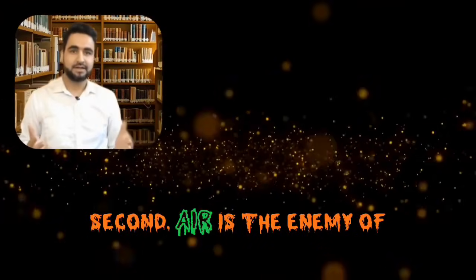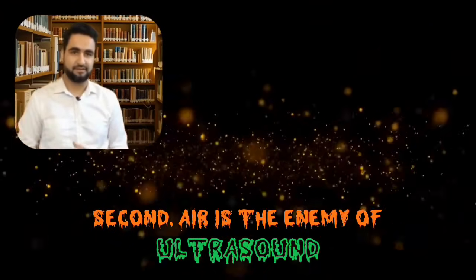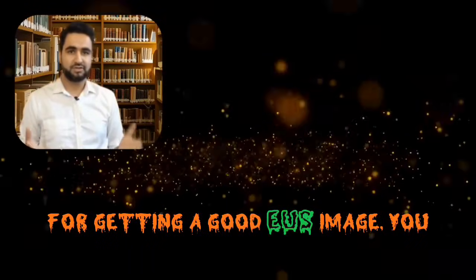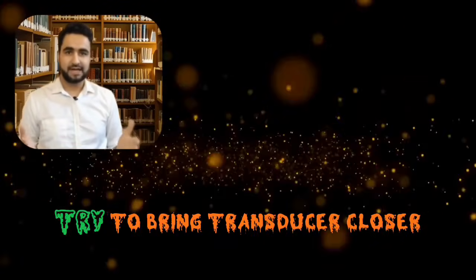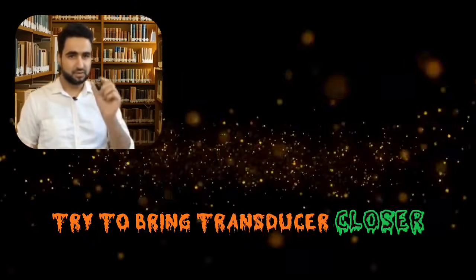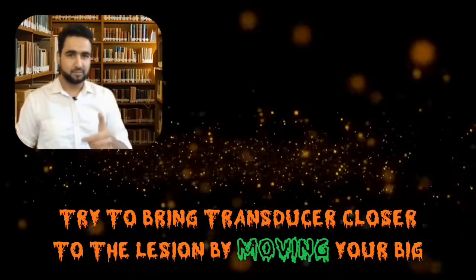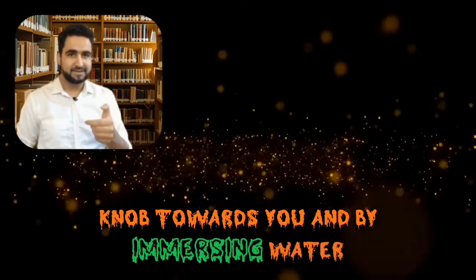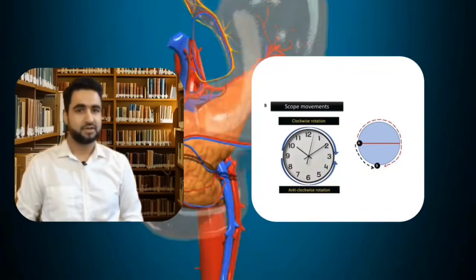The second basic point: air is the enemy of ultrasound. For getting a good EUS image you need to suck air. Try to bring the transducer closer to the lesion by moving your big knob towards you and by immersing water.